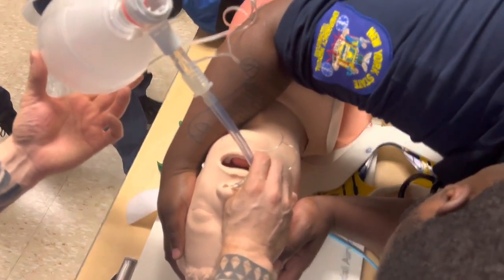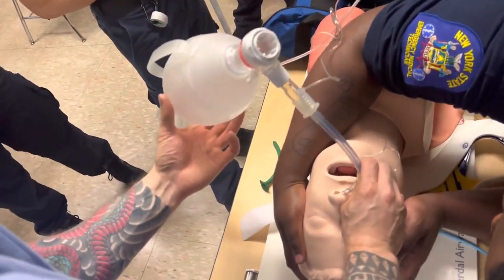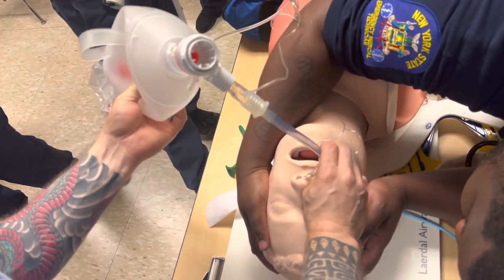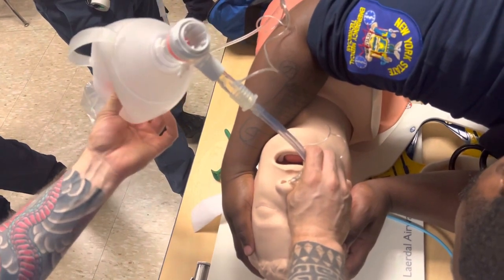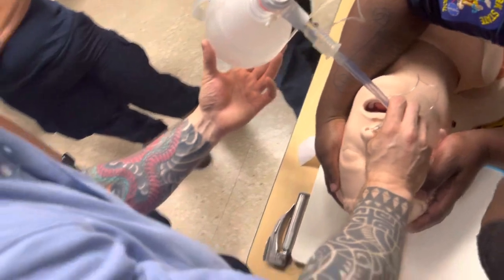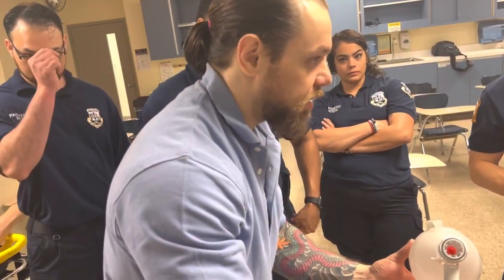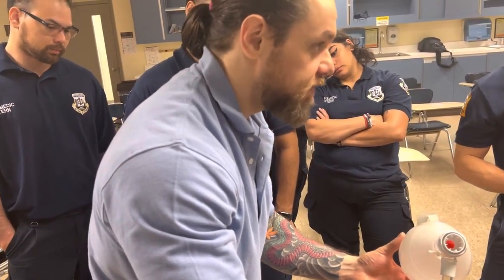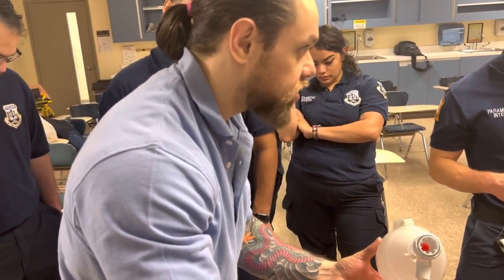So if I'm going to listen to the right side, I'm going to have positive lung sounds. I listen to the left, I'm going to have negative lung sounds or no sounds, right? Should I be doing right away gastric decompression? No, right? You should be pulling back on it. 3 times the diameter of the tube, right? So very good. So auscultation is my subjective data. And then I'm going to look at my pulse ox, right? I want it to read as high as possible or whatever the number may be, right? So the objective data is end-tidal CO2 and pulse ox. Subjective data is what? You seeing it go through the vocal cords and auscultation of the lung sounds, right?